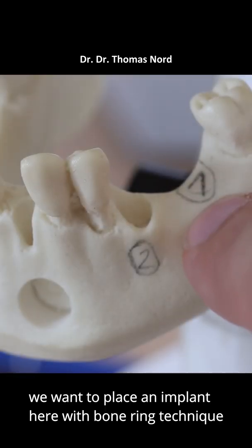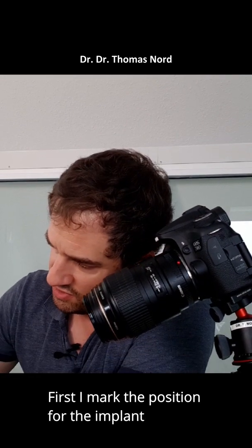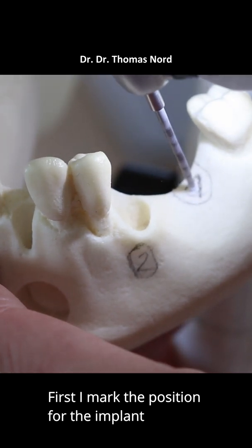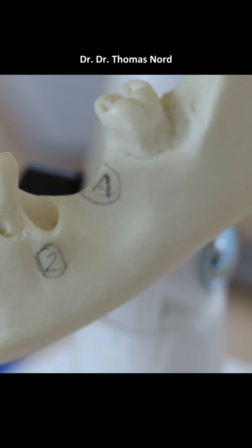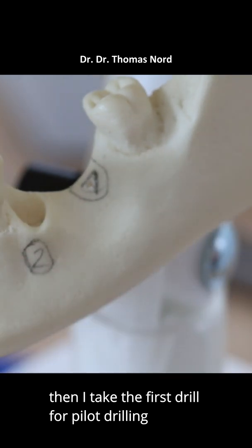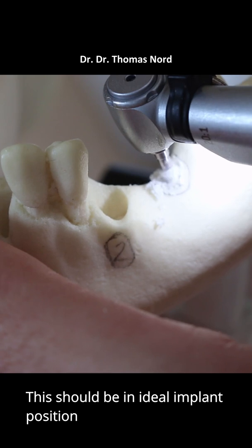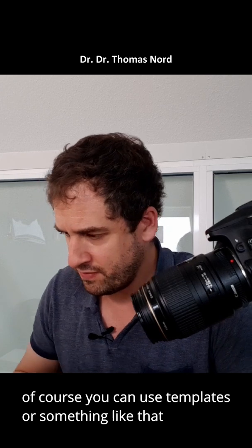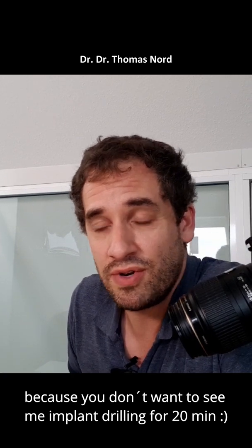We want to make an implant here with the bone ring technique. First I mark the position for the implant. Then I take the first drill for the pilot drilling. This should be an ideal implant position. Of course you can use templates or something like that. Here we do it very fast, because you don't want to see me drilling for 20 minutes.